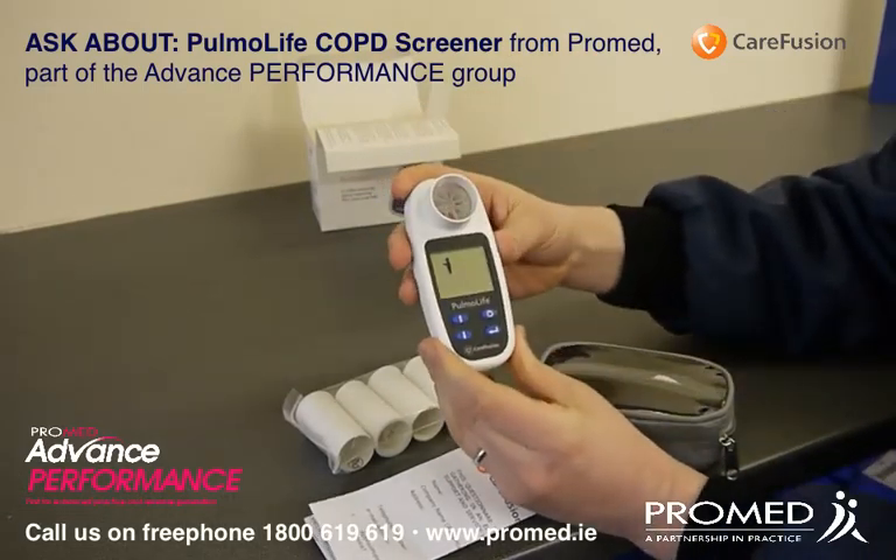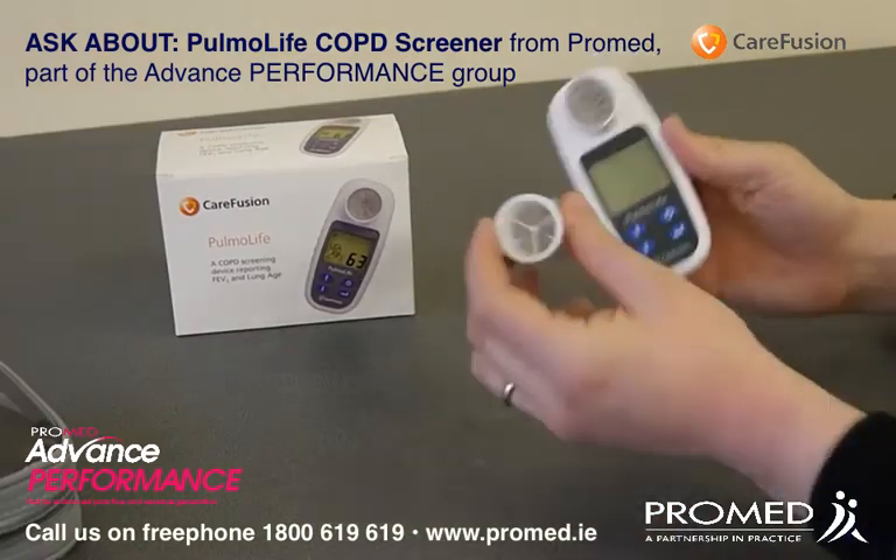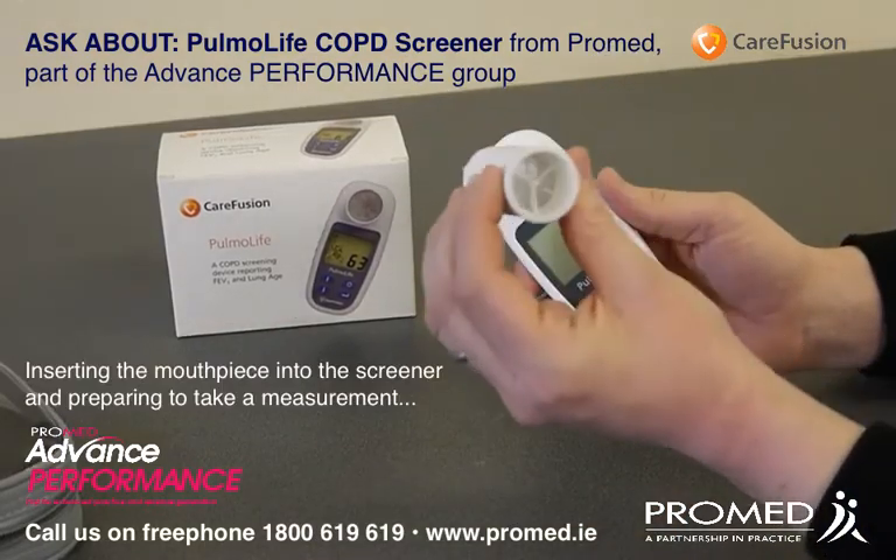We will now prepare the device to take a measurement. First of all, we will insert a one-way mouthpiece into the device.